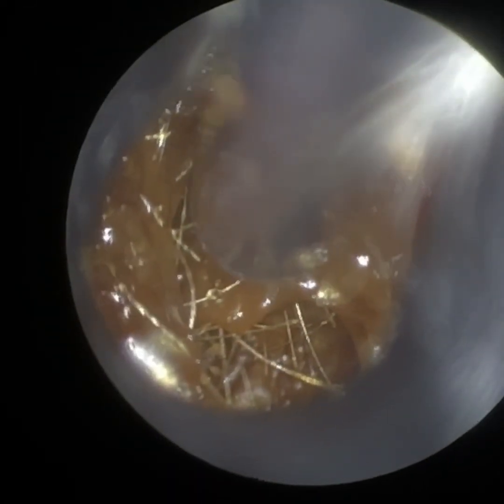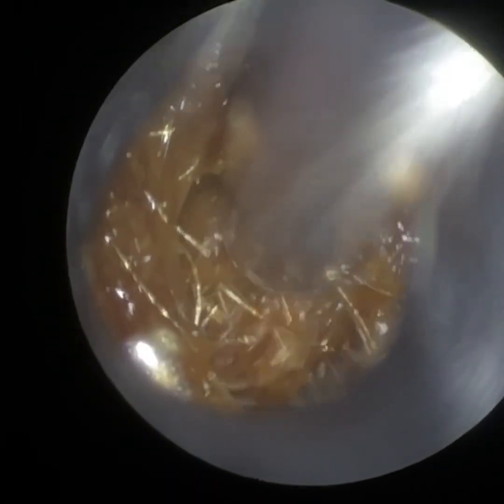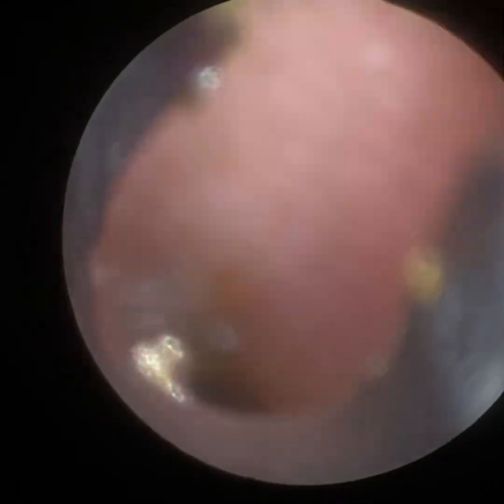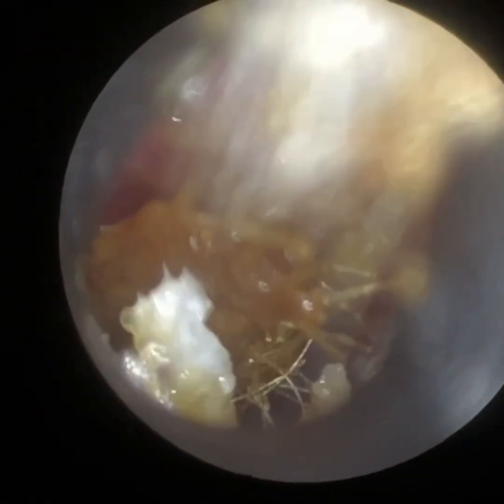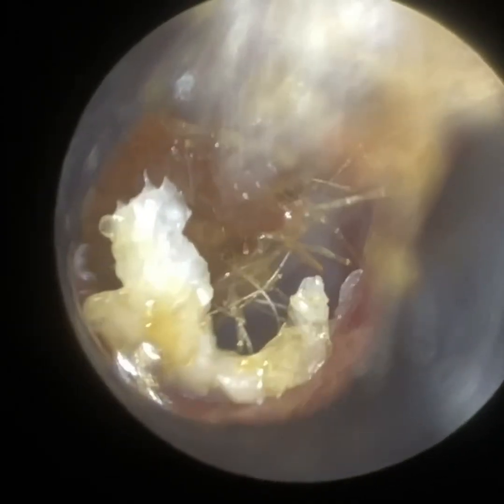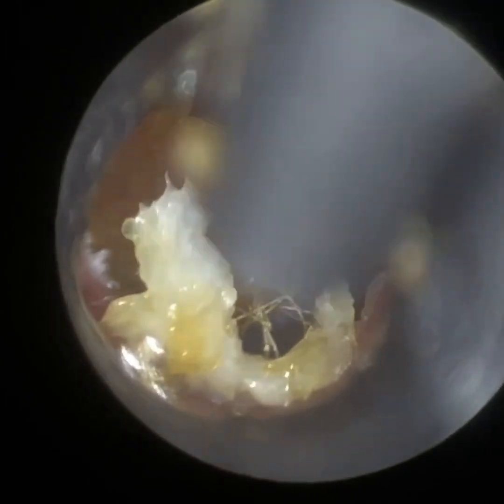Just got it in focus, getting the sucker in, we're just going to make contact here. There's a lot of keratin — the white stuff — it's dead skin that's adhered and enveloped itself around the wax, and it's also connected to the ear canal. Just some residual debris there, I'm just going to get it in focus.